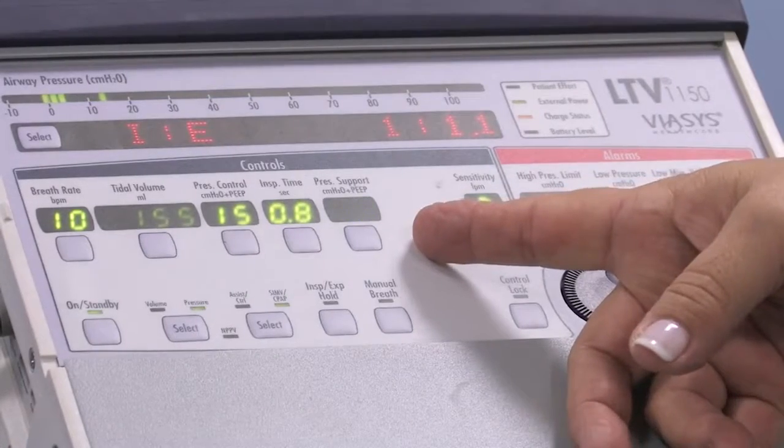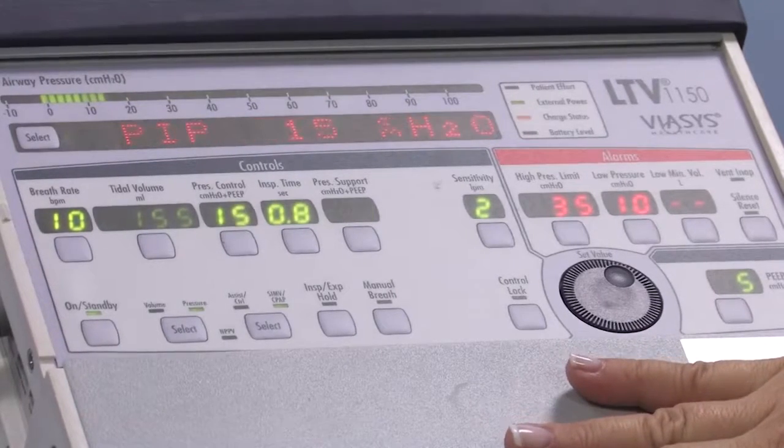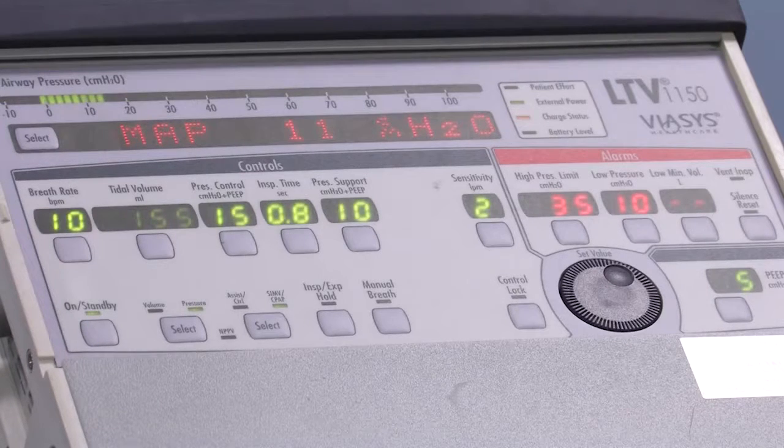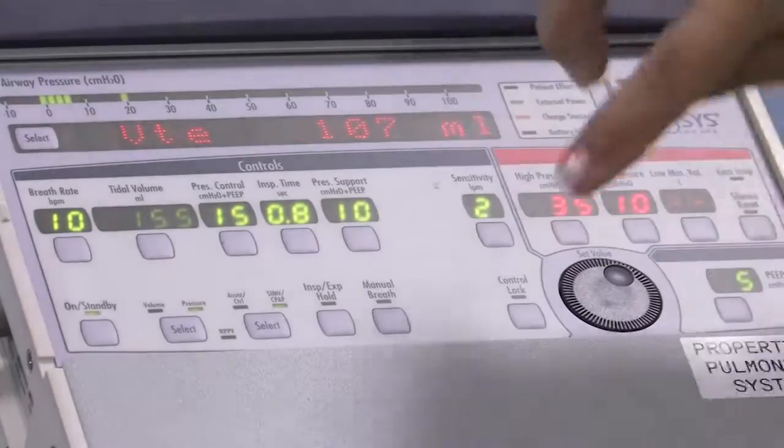What you might notice here is that this 10 is flashing, and that is one of the internal settings for pressure support ventilation. Because pressure support is what we call a spontaneous mode, we don't tell your child how many pressure support breaths they're going to get. They take them whenever they want them. So if they initiate a breath and trigger a breath, you see the trigger light going off, they will get one. If they happen to have a leak because the cuff or the balloon on the tracheostomy tube is deflated so they can phonate, or they don't have one at all, if there's a larger leak of air coming out the nose and the mouth, the machine doesn't know when your child's done with that breath, because we have inhale and then they go to blow out, but if some of it's coming out the nose and mouth, the machine can't sense that. So under the internal settings of the machine, we have set a timeout for that breath.